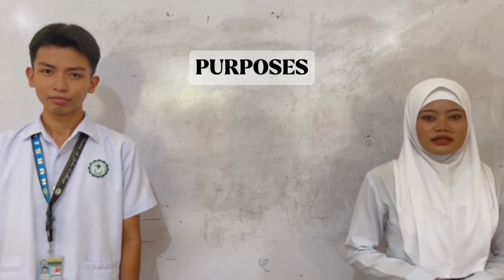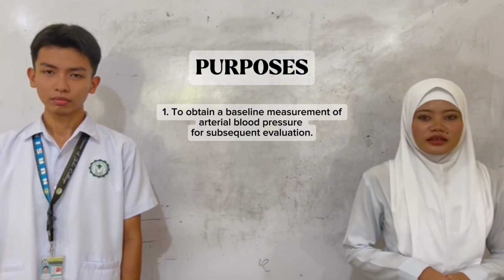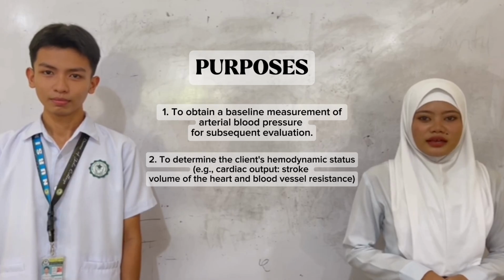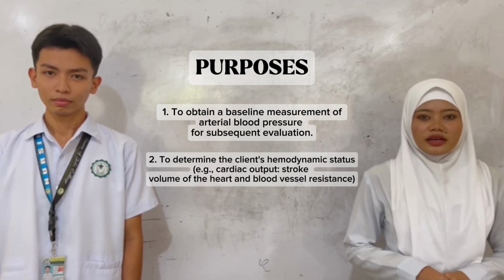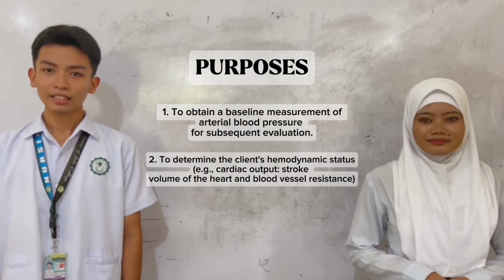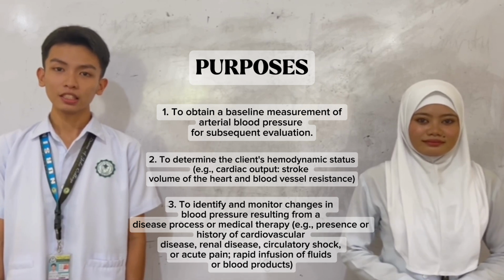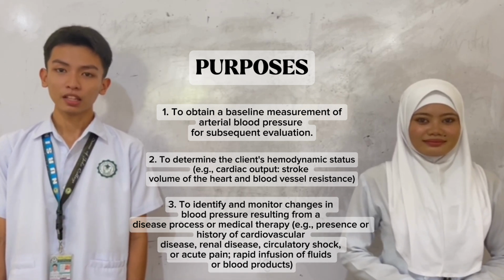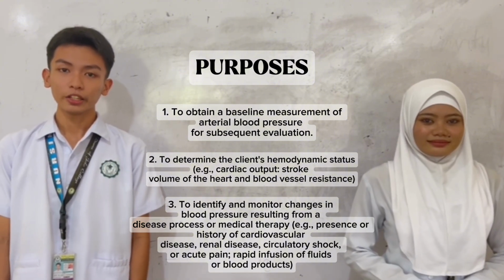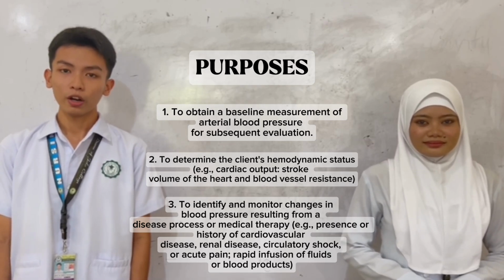The purposes of assessing the blood pressure are, first, to obtain a baseline measurement of the arterial blood pressure for subsequent evaluation. Second, to determine the client's hemodynamic status, for example, cardiac output, stroke volume of the heart, and blood vessel resistance. And lastly, to identify and monitor changes in blood pressure resulting from a disease process or medical therapy, such as presence or history of cardiovascular disease, renal disease, circulatory shock, or acute pain, rapid infusion of body fluids, or blood products.